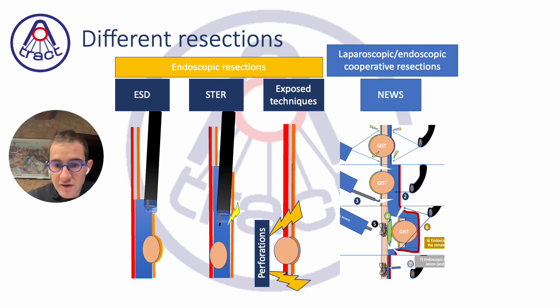Strategy of non-exposed perforation into a tunnel. It is the STER. We will present this technique today. Or some physicians prefer to do an exposed technique with a complete perforation, which is closed after the resection.